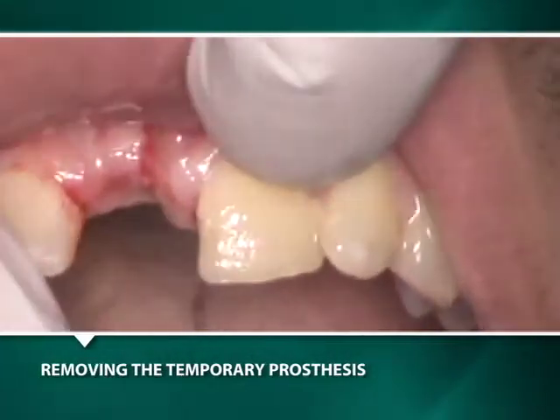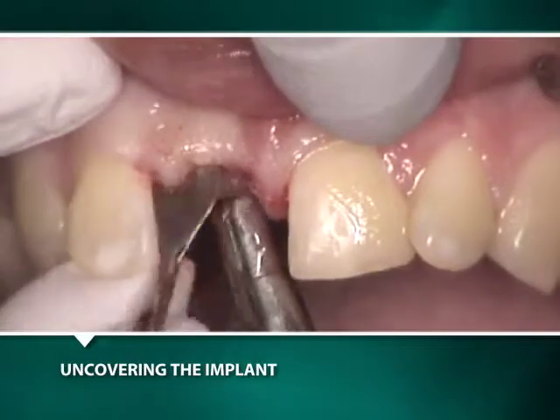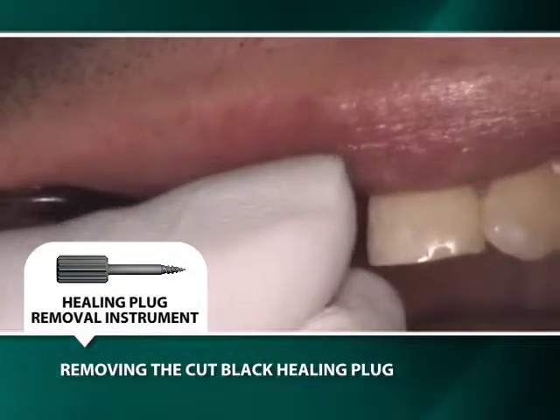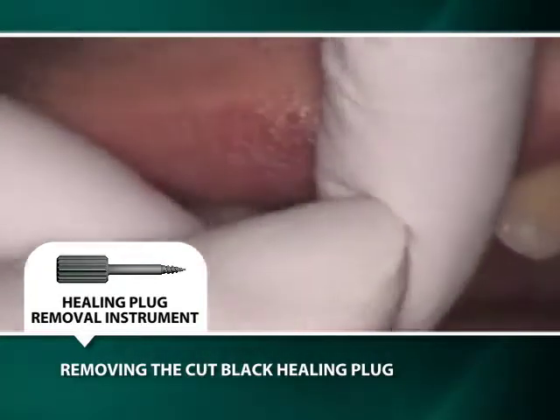Three months after the implant placement, the implant is uncovered and the black polyethylene healing plug is removed with a healing plug removal instrument, as if it were a cork in a wine bottle.